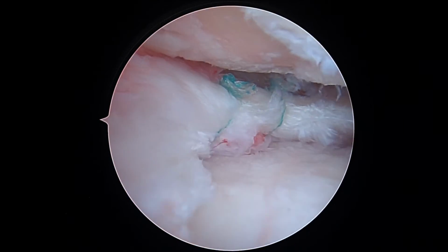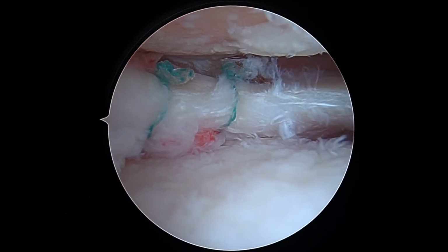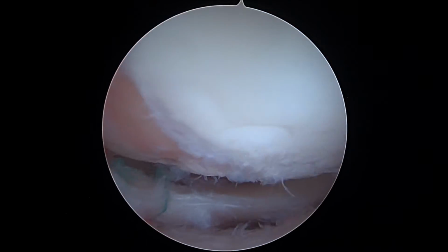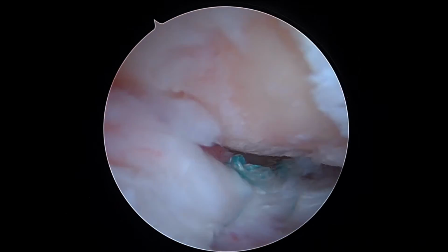At the very, very end of the case, we're going to inject our PRP right there using a spinal needle, probably a 22 gauge spinal, maybe even a 25 if you have one. But we may even do a little microfracture.